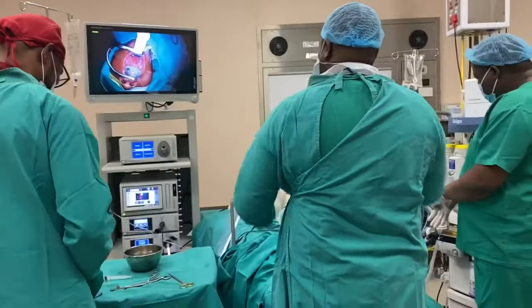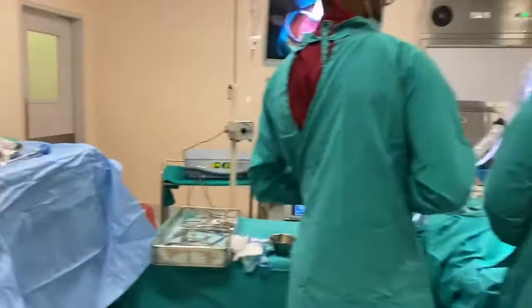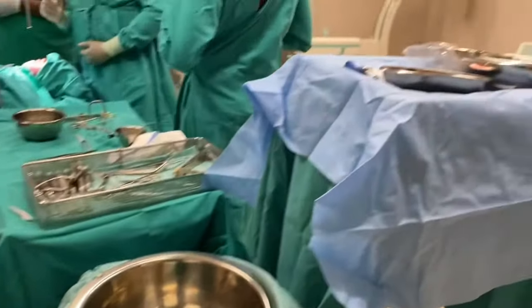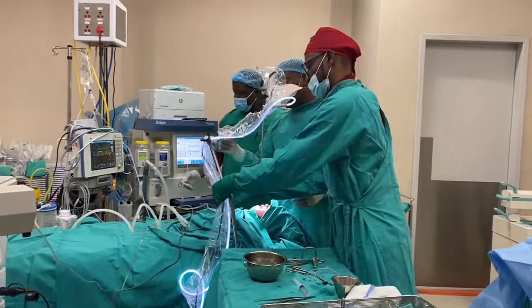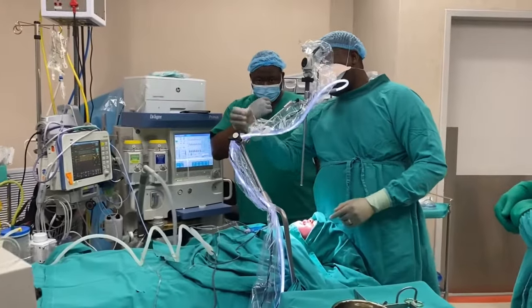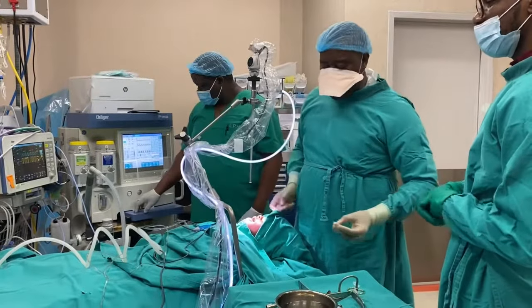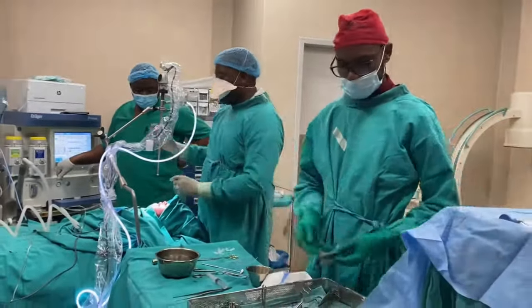Super. You have to remember with your technique — you have to stay in the plane. This is my modification, because it used to hang around like this. Then one day I thought, you know, I'm old enough to adapt. So I put this around and it looks good. Thank you very much. Thank you very much.